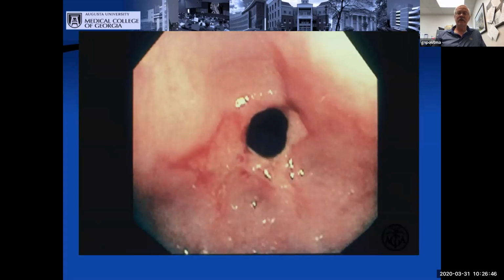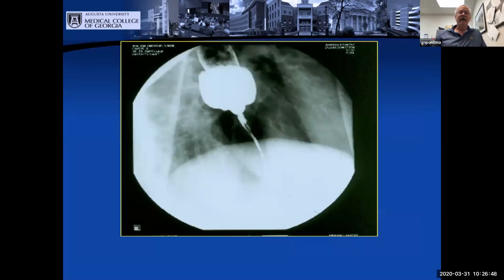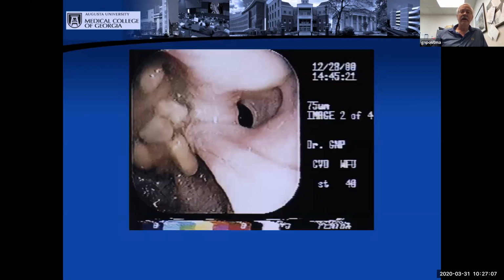Post-radiation stricture. This is kind of funny, actually. This is a long time ago. This patient was sent down for solid food dysphagia, and we just do same day. We don't bother with being NPO. If you just pop in the clinic, we'll take a look at you. This patient, we thought it was a cancer. You had an obstruction and a pre-stenotic dilation, and we were sure this guy had a tumor. We did have a stricture and a diverticulum form.